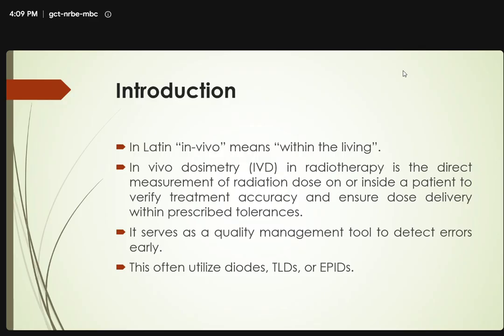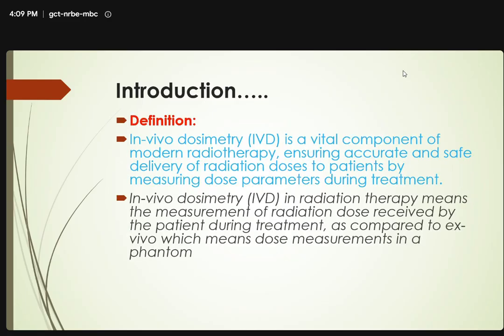So, in Latin, in vivo means within the living. So, in vivo dosimetry, this IVD in radiotherapy, is the direct measurement of radiation dose on or inside a patient to verify treatment accuracy and ensure dose delivery within the prescribed tolerances. It serves as a quality management tool to detect errors early. This often utilizes diodes, TLDs, OSLDs, or EPIDs.